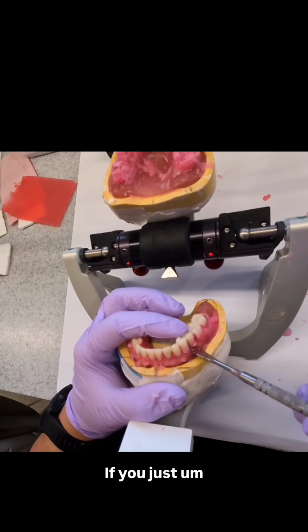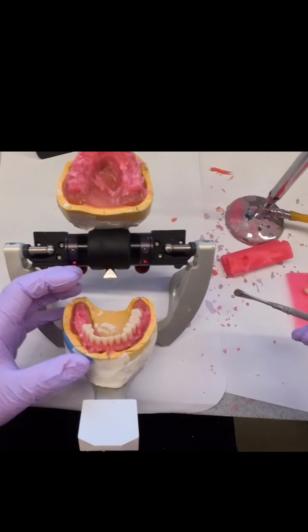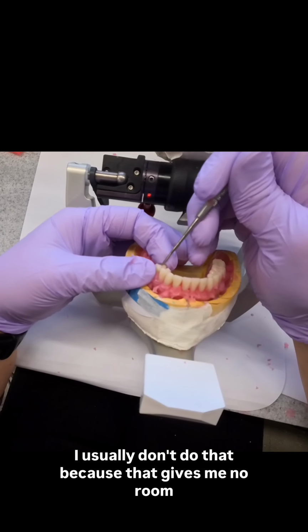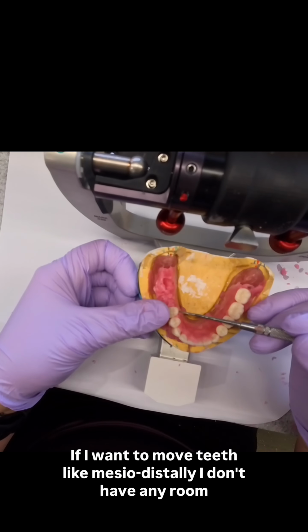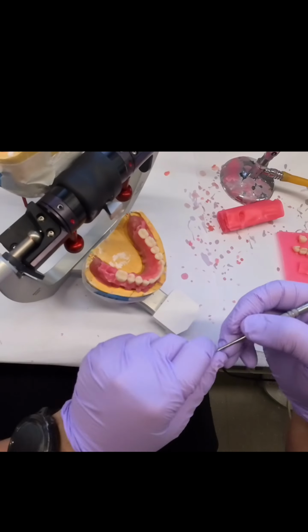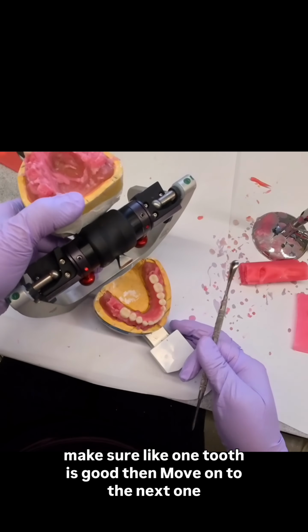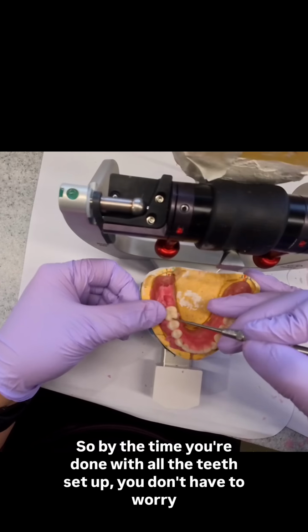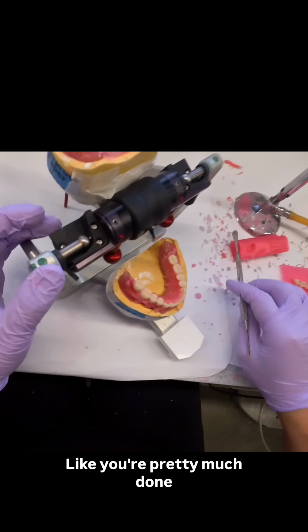I know that some people like to put all the teeth in the arch and then start doing adjustments. I usually don't do that because that gives me no room. If I want to move teeth mesiodistally, I don't have any room. And so I usually make sure one tooth is good, then move on to the next one. So by the time you're done with all the teeth setup, you don't have to worry about the adjustments. You're pretty much done.